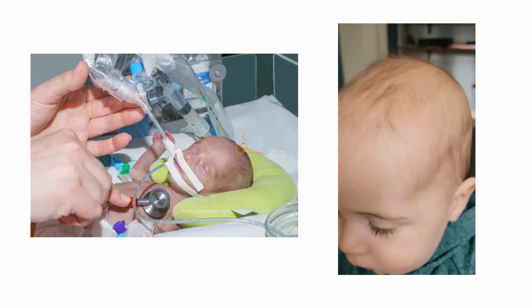In situations like this, what you might have to do is use a sector probe, or a probe that can actually fit in it, to give you the images. At the same time, over here, you have a very large fontanelle. If you start using a sector probe or a linear probe, what is going to happen to your footprint? It's going to be very small and cover a very narrow, limited area. So actually a curvilinear probe would be much better over here.